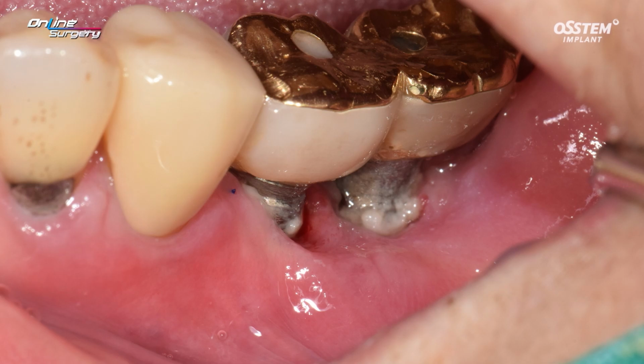If you look at the oral photo, the soft tissue contour is not very good. I'm not sure whether it was like that from the beginning or due to the peri-implantitis. Anyway, soft tissue contour is not very good. Therefore, soft tissue improvement should be included in the plan.